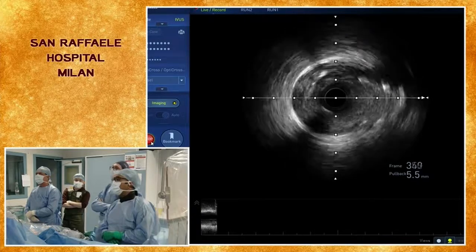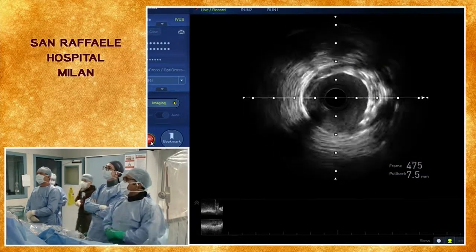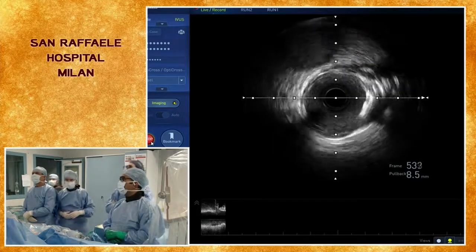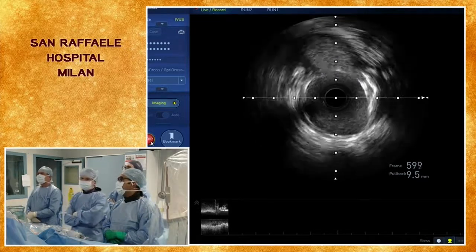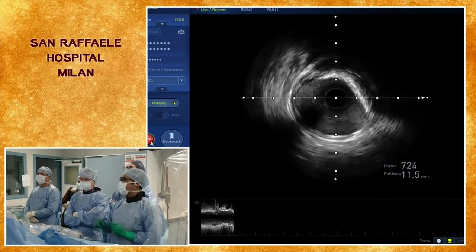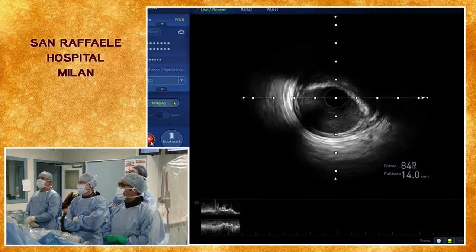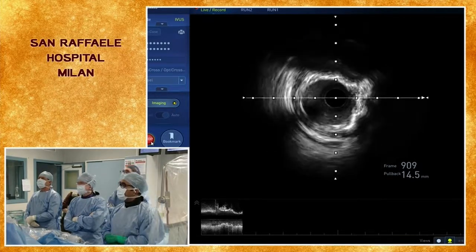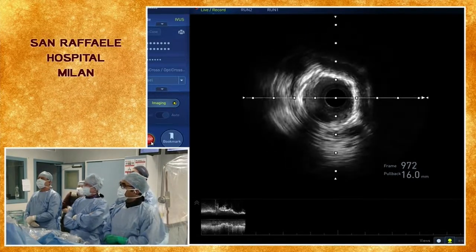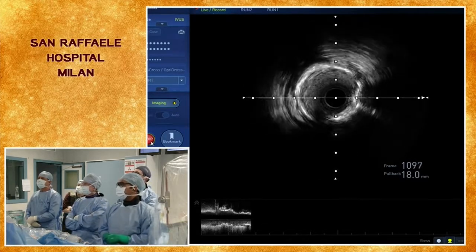So here we come to the bifurcation. How is the situation here? Here we're doing an IVUS. You come at the perfect time, so we have to make a decision. This is an IVUS on the LAD after we've stented and kissed both diagonals. This is the mid-LAD where there's a previous stent, which you see is a bit underexpanded. But not bad. Your lumen's not bad. It's circular.